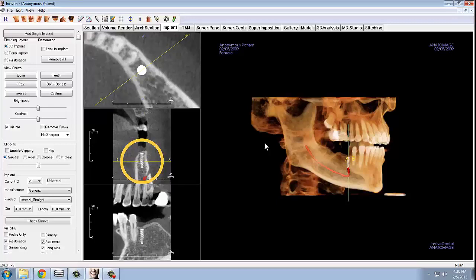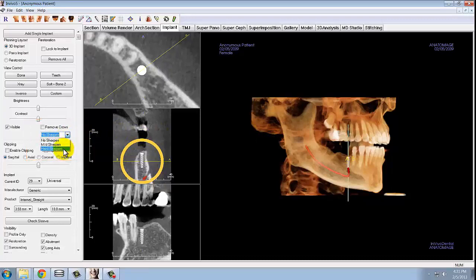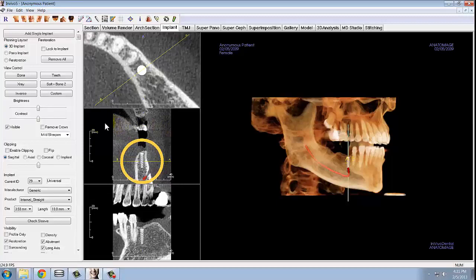Another useful tool in the software for accurately visualizing the bone boundary is the sharpening filter. In the control panel, you can set the level of sharpening for the 2D cross sections to no sharpening, mild, or hard sharpening. Using these filters may improve your ability to place the implants.